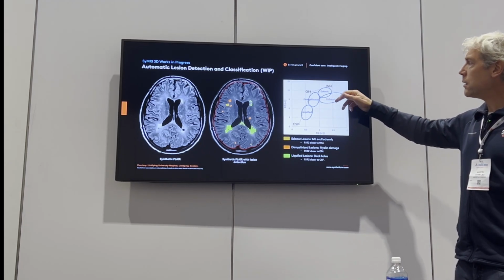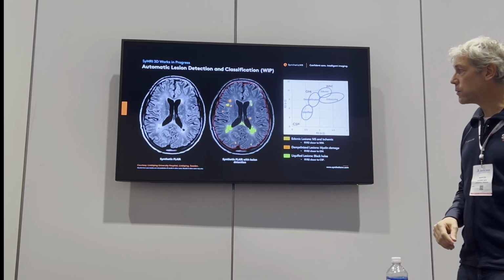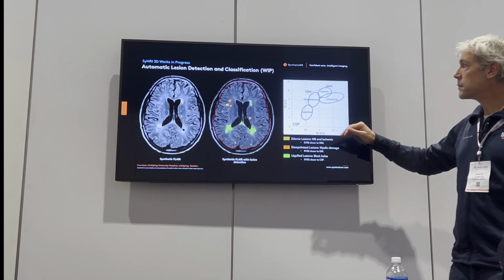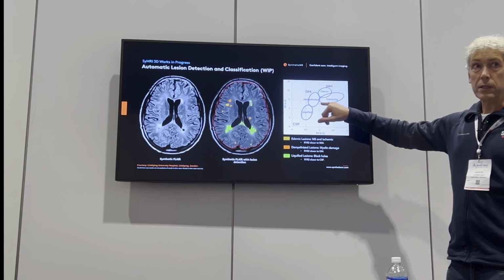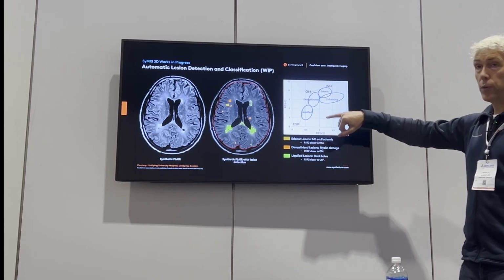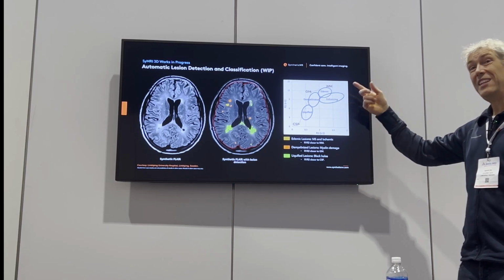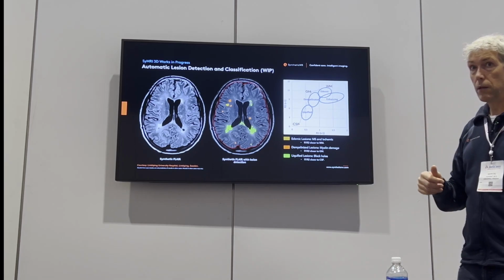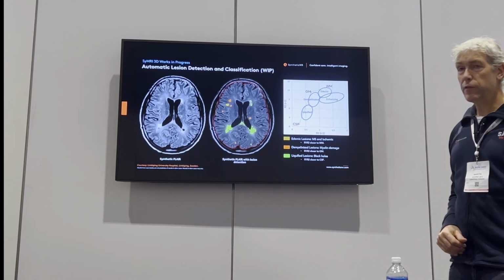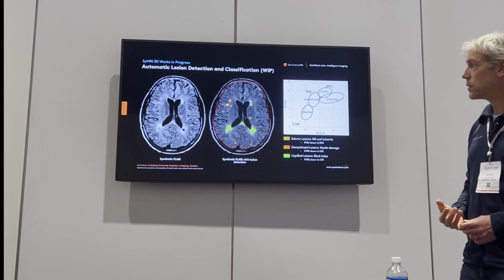If you have a demyelination, you would probably have traveled towards this part here with a lower R1 and a lower R2 simultaneously. It's kind of arbitrary where that cutoff is, of course, but here is really the myelin damage. And we also notice that if you administer gadolinium, you end up in the enhancing part. If you look at the pre-GAD images, they're always here. So if you're here, it doesn't say that you're enhancing, but if you're enhancing, you came from there. Right, so that's also a nice sign that this is in the separate area. Well, this is what we call liquefied, but it's kind of the black holes. So they are very close to CSF. They're really burned out lesions.